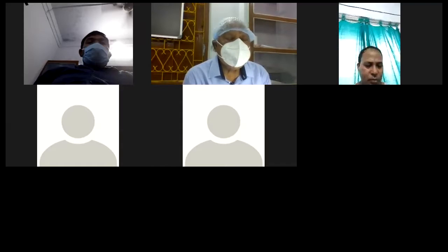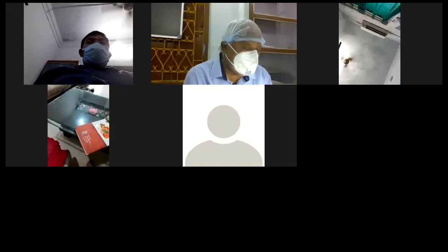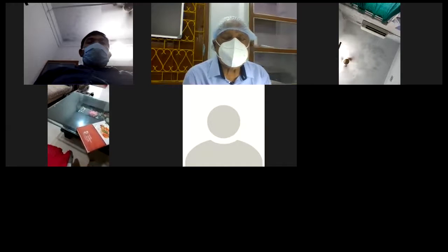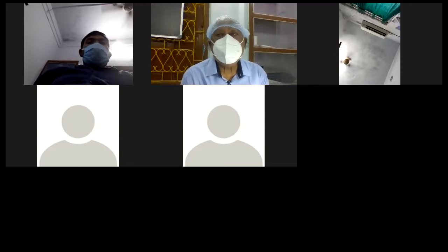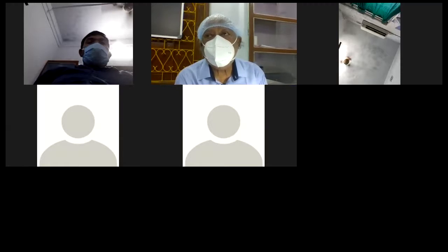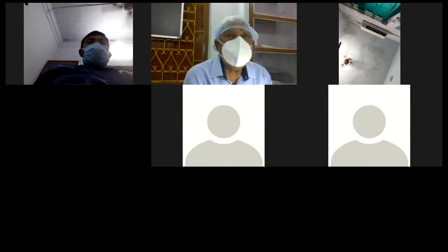First of all, what is the purpose? The first purpose of the ultrasound machine for the obstetrician is to know the first trimester pregnancy. The most important thing is the viability of the embryo or the fetus. So it will be a real-time ultrasound.